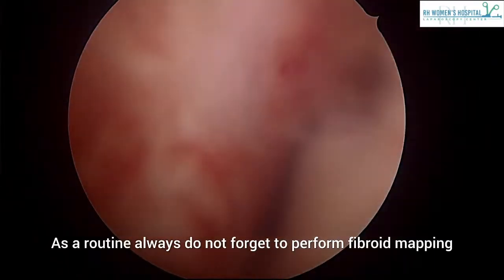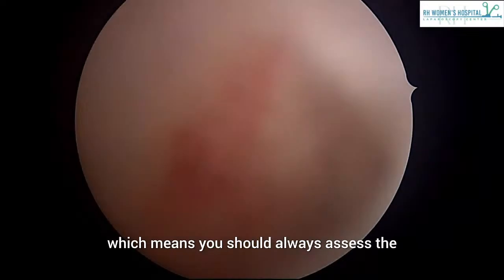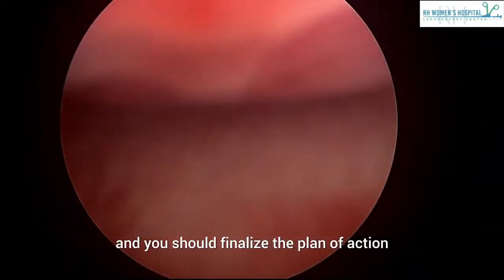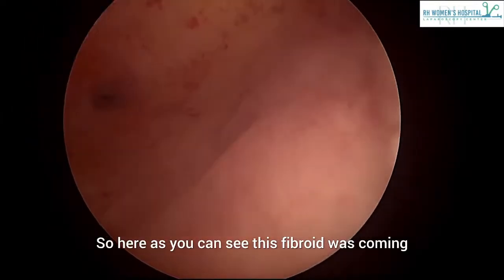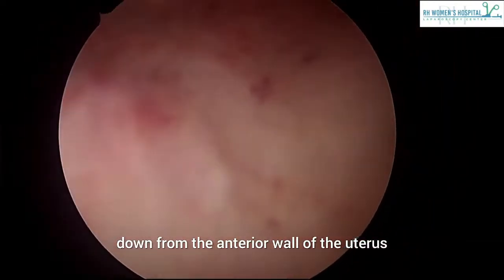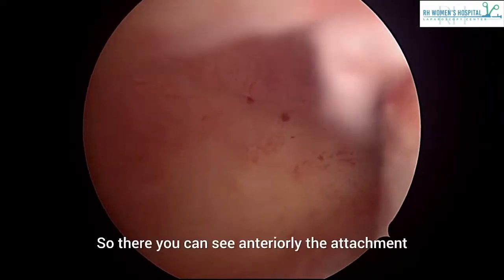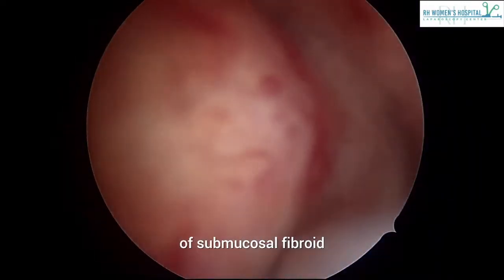As a routine, always do not forget to perform fibroid mapping, which means you should always assess the lesion from all its borders and you should finalize the plan of action. So here, as you can see, this fibroid was coming down from the anterior wall of the uterus and rest of the cavity was looking absolutely within normal limit. So there you can see anteriorly the attachment of submucosal fibroid.